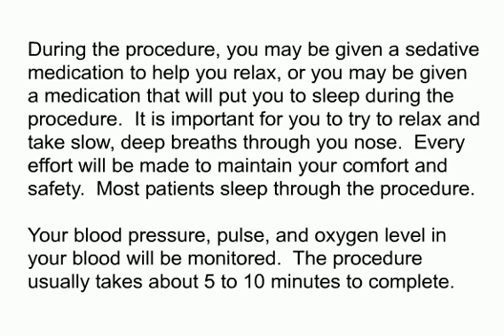During the procedure, you may be given a sedative medication to help you relax, or you may be given a medication that will put you to sleep during the procedure. It is important for you to try to relax and take slow, deep breaths through your nose. Every effort will be made to maintain your comfort and safety. Most patients sleep through the procedure. Your blood pressure, pulse, and oxygen level in your blood will be monitored.